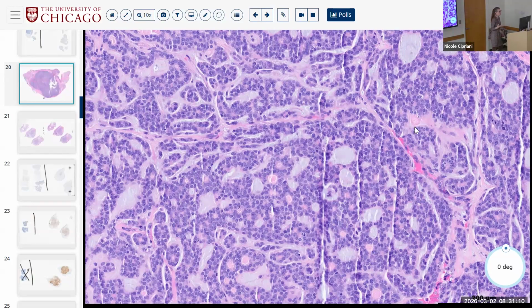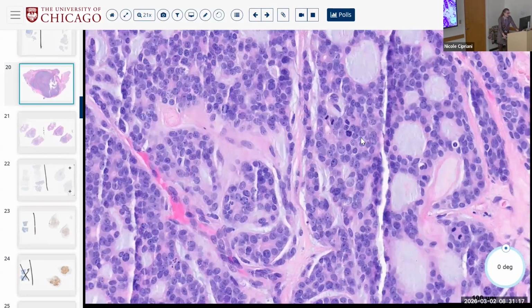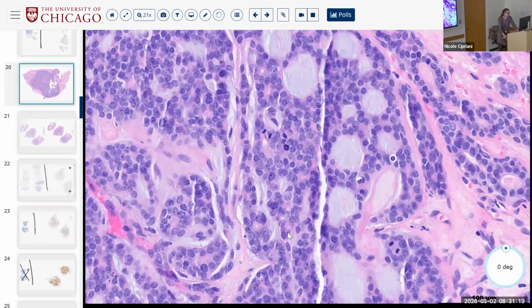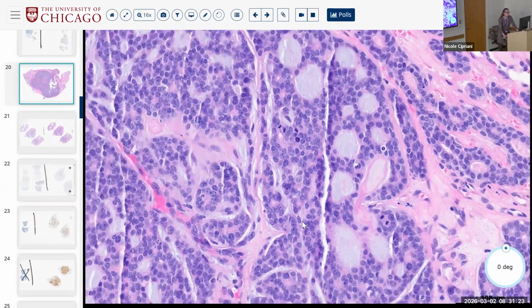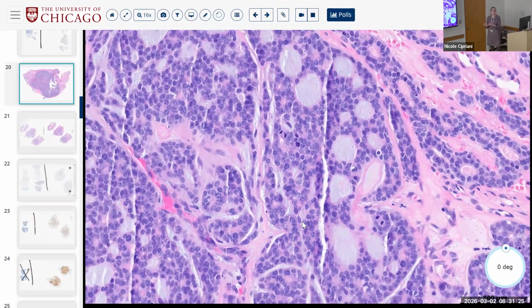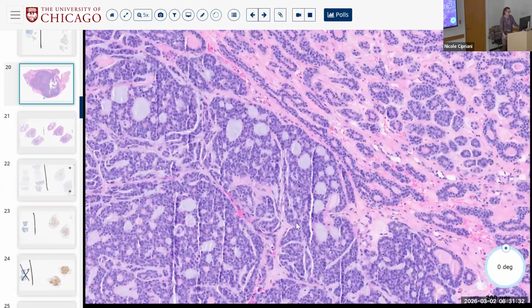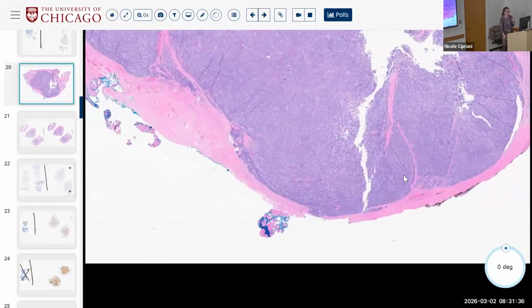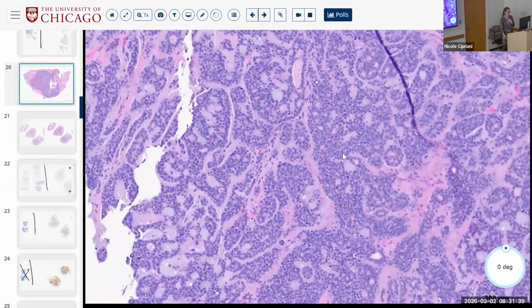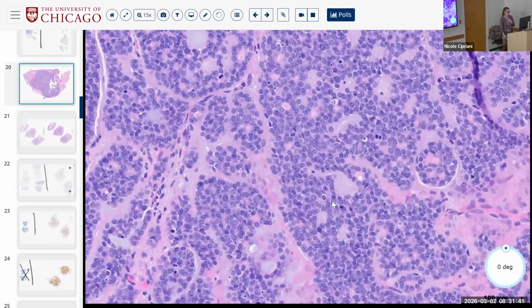I would say this isn't quite there yet. I can still tell it's adenoid cystic. So I'm not going to call it dedifferentiated, but I'm starting to notice, right, that there are scattered mitotic figures and that there is coarse chromatin in areas. So we might suggest that this is on its way, right? But there's no good, clear grading system for these, so we sort of have to be descriptive in many instances. We don't see overt necrosis, right? But we do see some cytologic features of maybe this is creeping to high grade in terms of its mitotic activity.